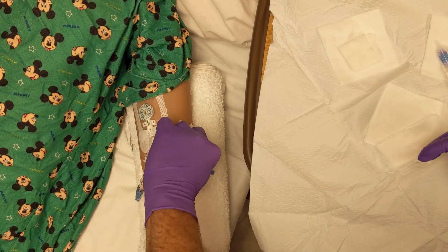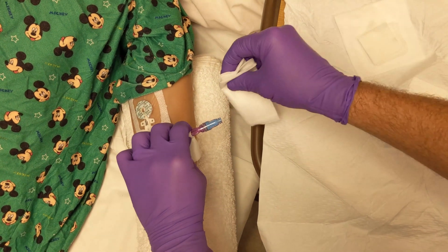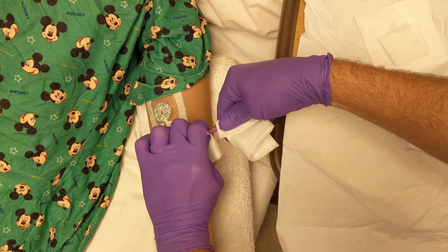With your sterile dominant hand and using another gauze, grasp the injection cap, disconnect and discard the cap away from your sterile field.